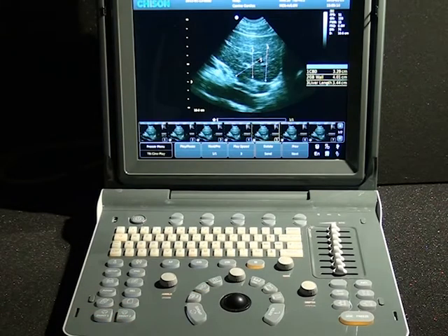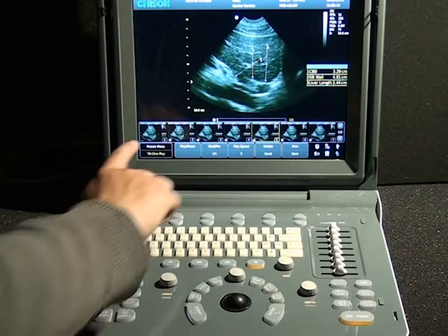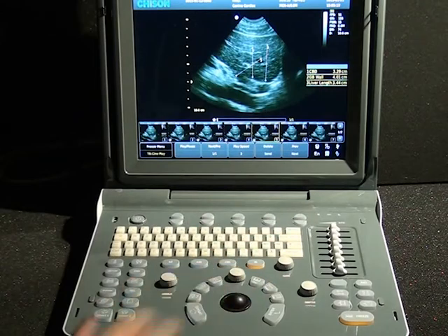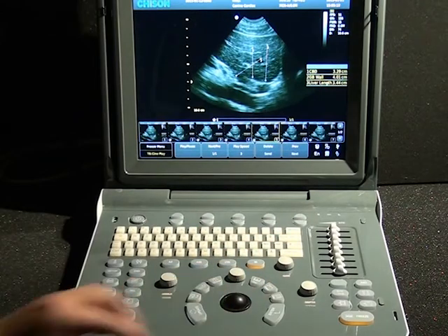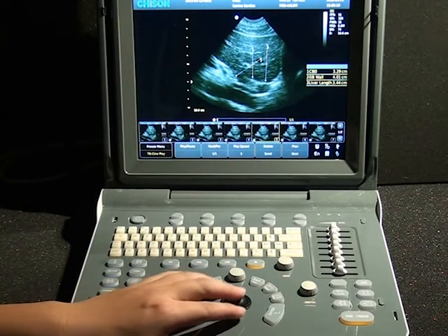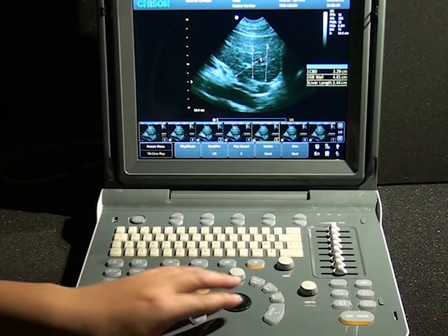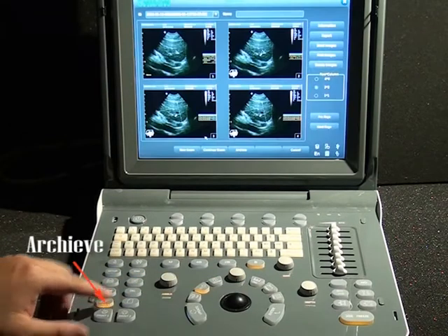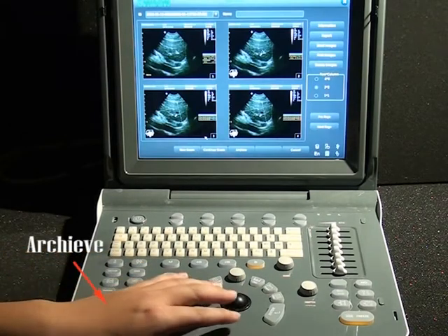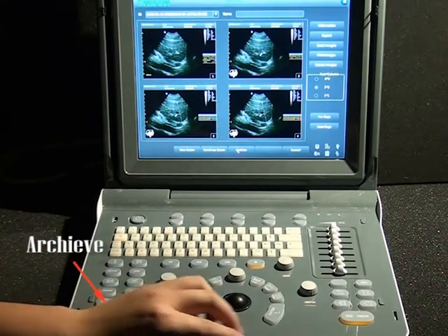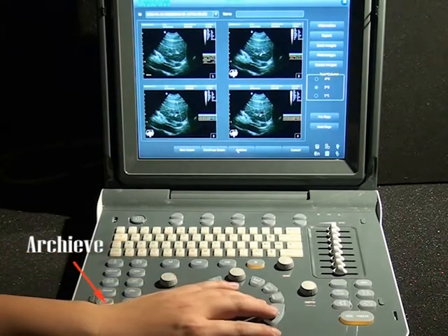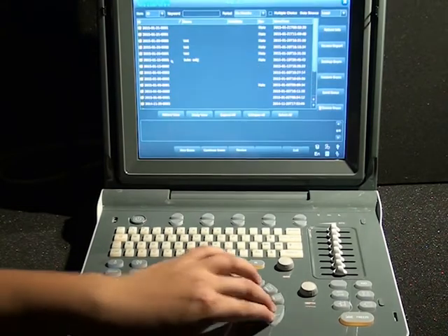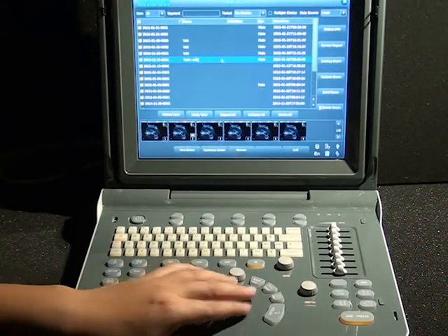As the images have been saved in the machine, we have several ways to export them to a USB disk. First, insert the USB disk. Press the Archive key, select Archive, then you can choose to send or backup the images.